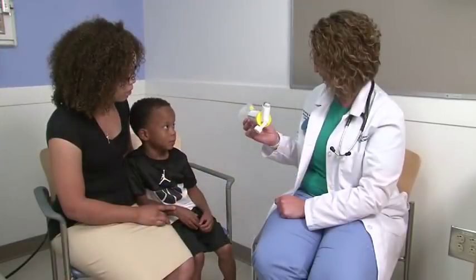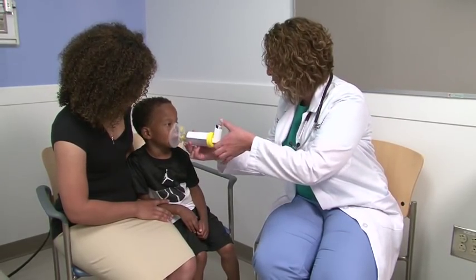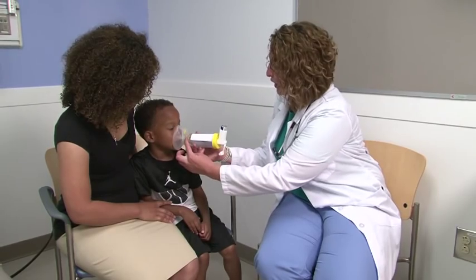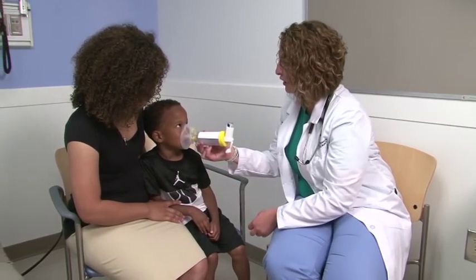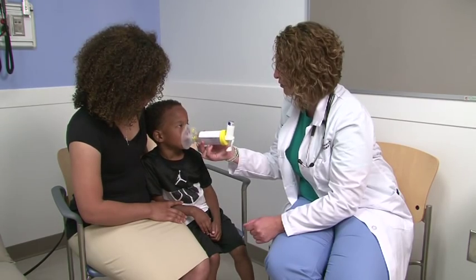Rinse your mouth out with water, or brush teeth, or get a drink after using controller medicines such as inhaled steroids. Many times, the correct dose of your medicine will be to inhale two puffs. If this is what is prescribed for you, then wait one minute after the first puff and then follow all of the steps again.